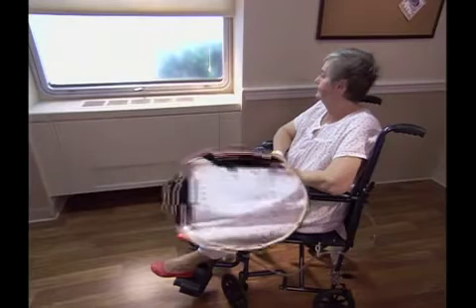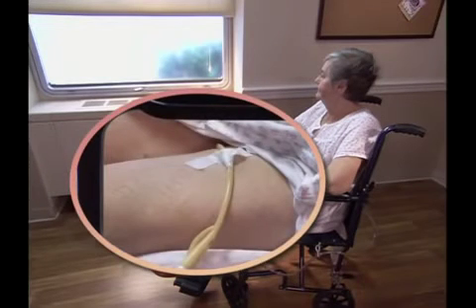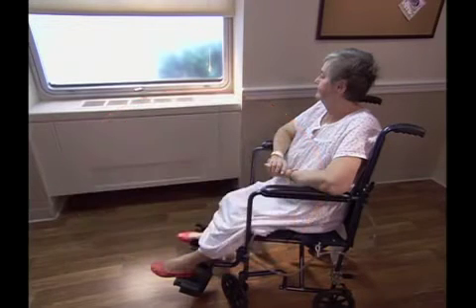With this type of bag, the tubing is secured loosely to the person's body near the insertion site using a catheter strap or, as in this case, adhesive tape. Securing the tubing to the person's body prevents the catheter from being accidentally pulled out during repositioning. In women, the tubing is attached to the thigh. In men, to the thigh or to the lower abdomen.